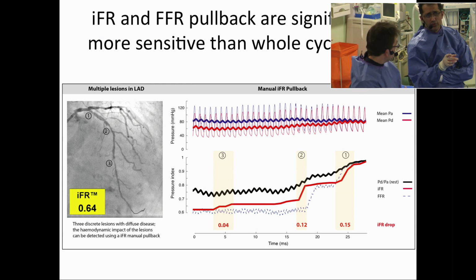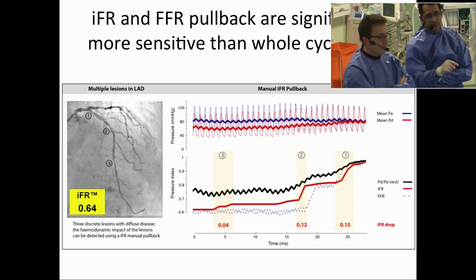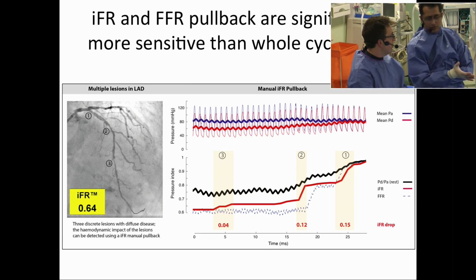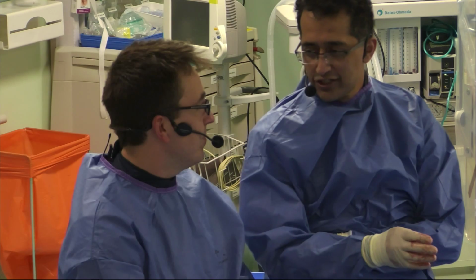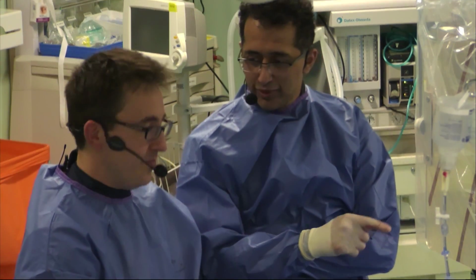I think the key with this case compared to that graphic is that that was a 0.6 iFR distally. So we have something big to gain by finding a spot to stent. Even if we stented long, we're still probably going to win. Whereas here, this is right in the grey zone, 0.89, 0.9. The gain is going to be marginal at best. And I suspect that PLV branch is probably causing his angina.